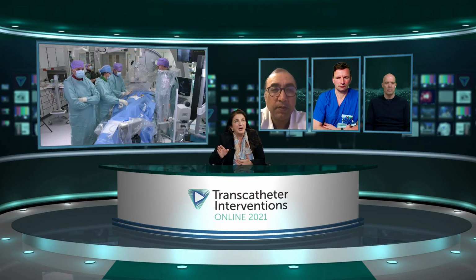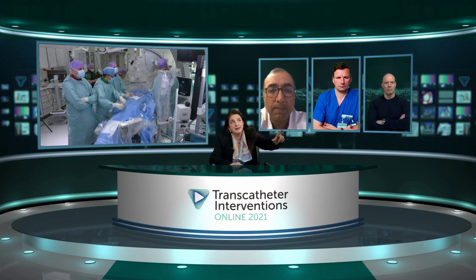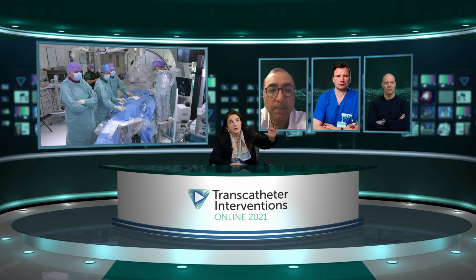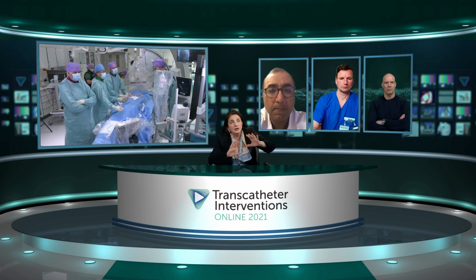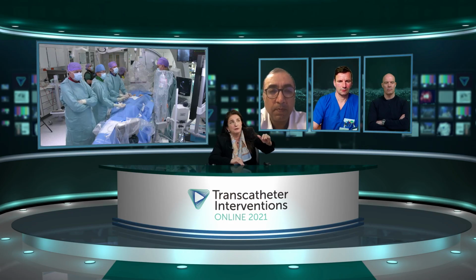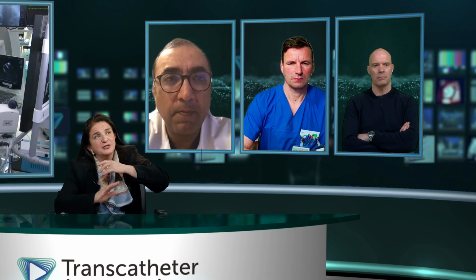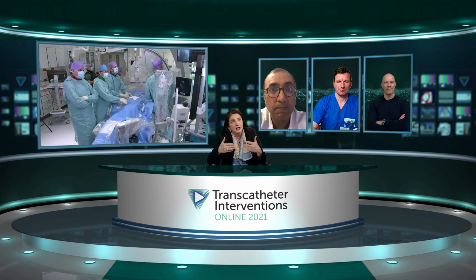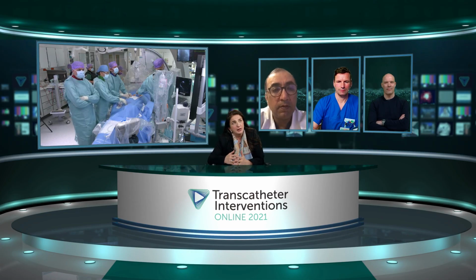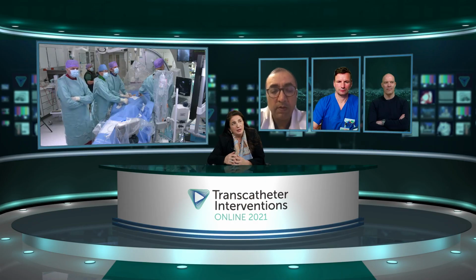I want to hear from the panelists just quickly, if it's okay, but let us know if you want to show us the device first, and then we can go to the closure. Whatever you like. We don't want to disturb your flow, Lars. Let us know if it's okay. I wanted to just discuss a little bit amongst the panelists about what they're using for pre-planning and intra-procedural imaging. Is that okay, Lars? Yes, sure. I want to make sure we're okay with that.